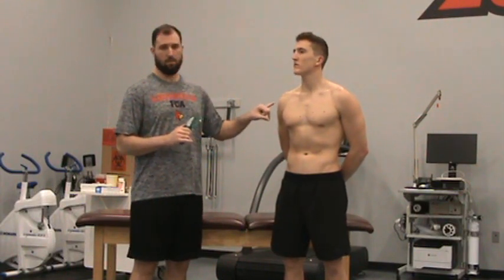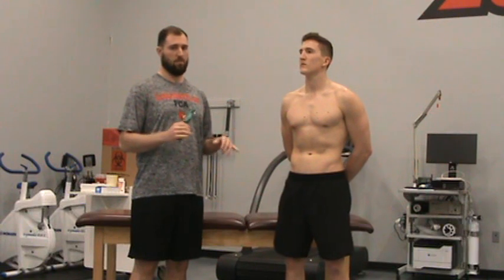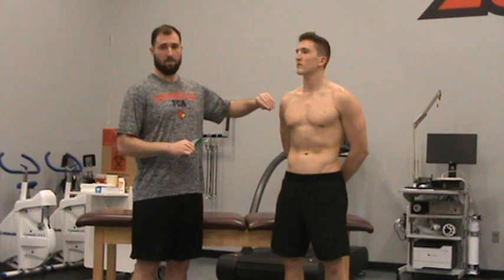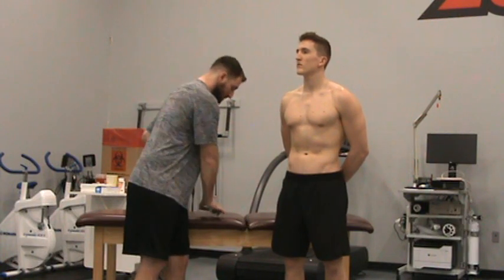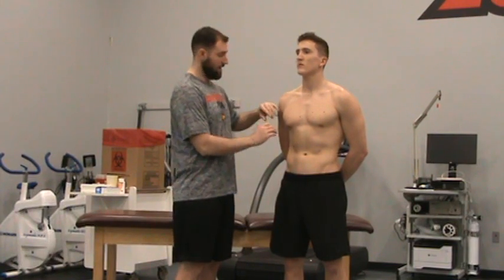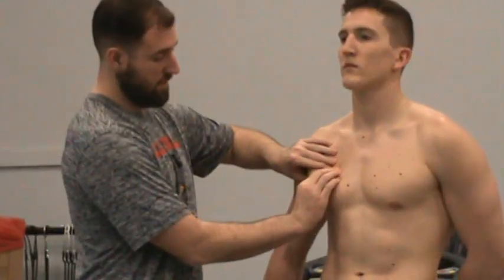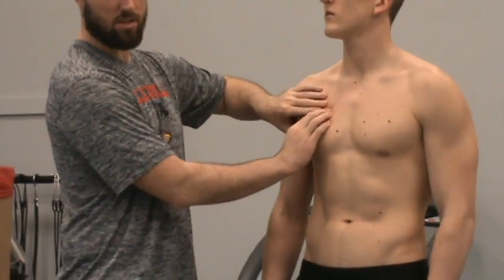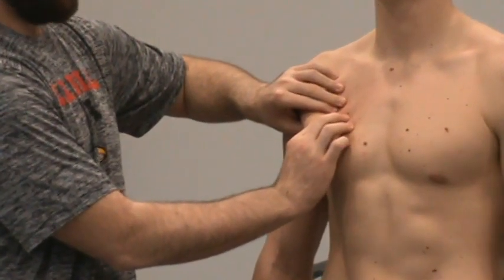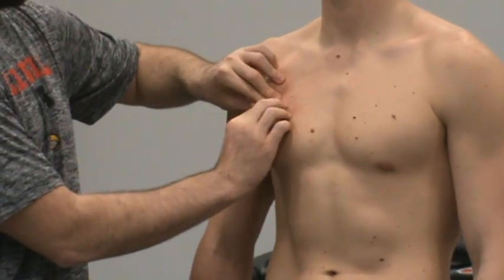Once you find your site, whatever that's going to be — I'll go over the direct placement stuff — what you're going to do is pinch up the skin. Don't be afraid to really dig in there. Let's say if I'm doing his chest here, I'm going to grab a big portion. I like to use two hands at first just to make sure I get a lot. I'm going to pinch until the muscle goes away, and that's how I know I can have just skin.